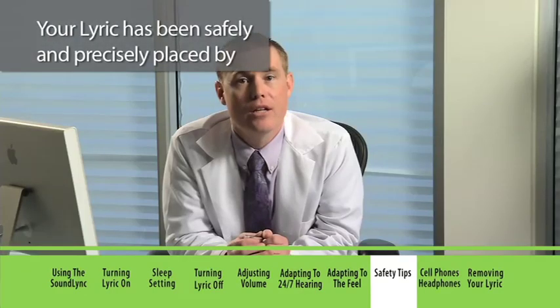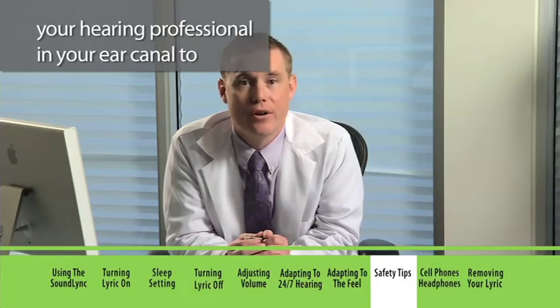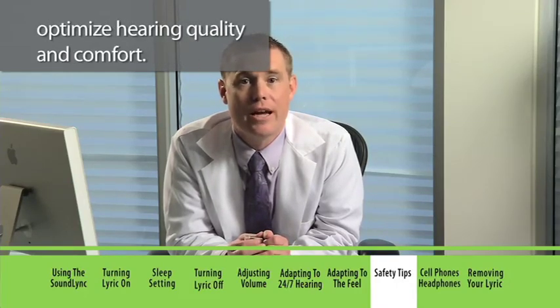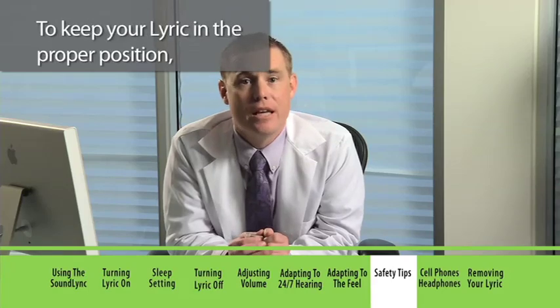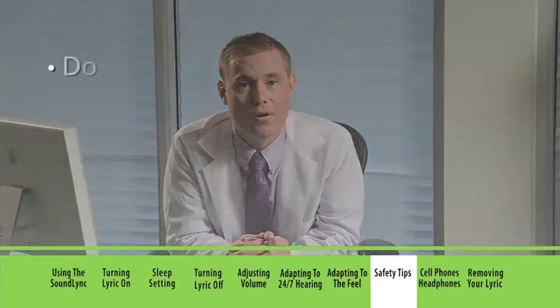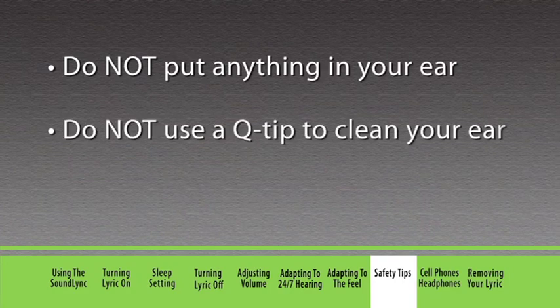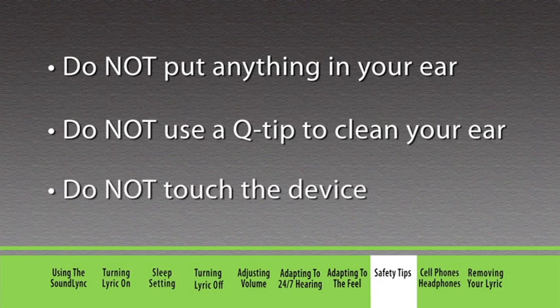Your Lyric has been safely and precisely placed by your hearing professional in your ear canal to optimize hearing quality and comfort. To keep your Lyric in the proper position, remember: do not put anything in your ear, do not use Q-tips to clean your ear, and do not touch the device once it's placed in your ear.